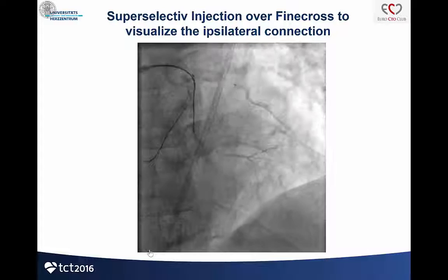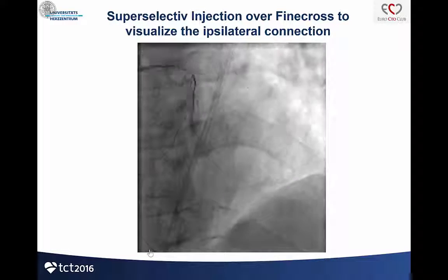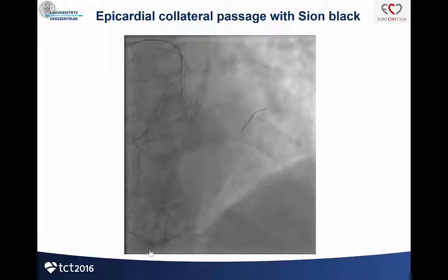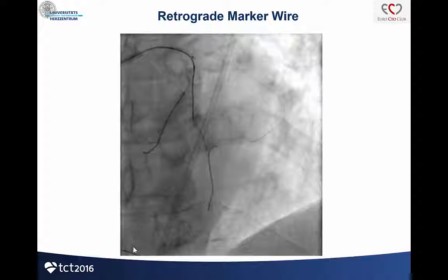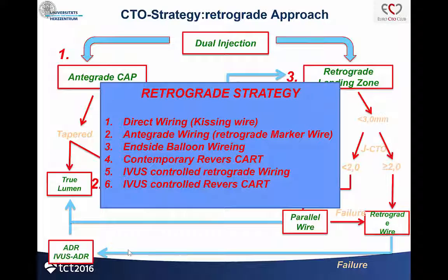I show you next a super-selective injection in this diagonal. You can see very nice connections to the distal landing zone. The question is: can these connections help me for my procedure? It was not complicated to pass here with the Sion wire, and I could bring the Sion wire down to the LAD. So I had something like a marker wire situation. I then tried to penetrate again towards the retrograde wire, but I failed.